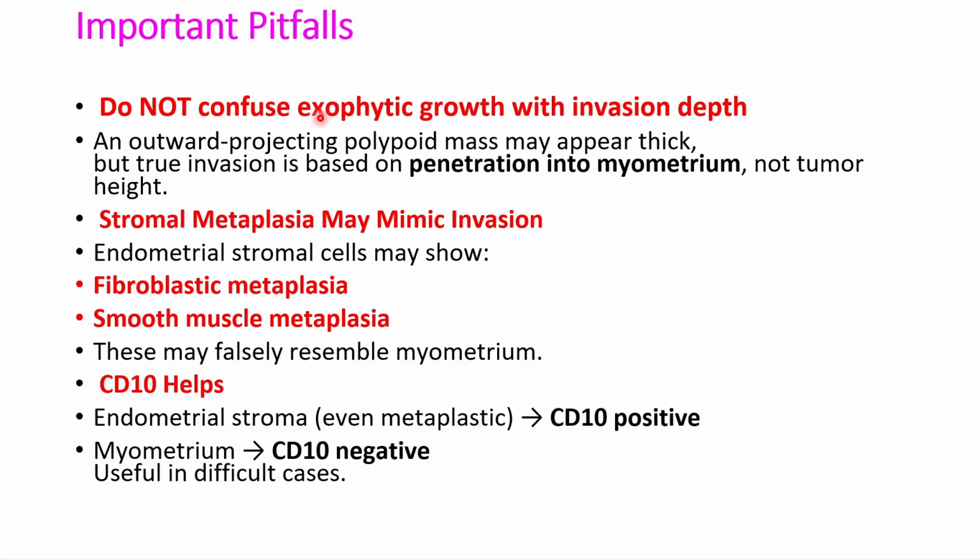Now, important pitfalls. So do not confuse exophytic growth with invasion depth. An outward projecting polypoidal mass may appear thick, but true invasion is based on the penetration of this tumor into myometrium. So it is not actually the tumor height. Now stromal metaplasia may mimic invasion.